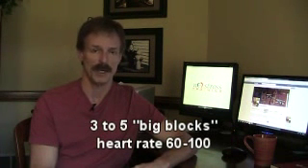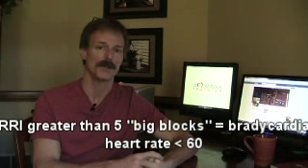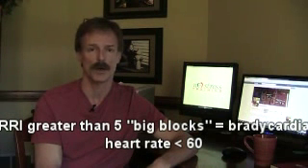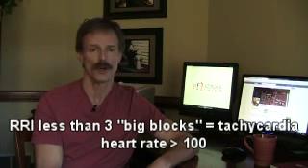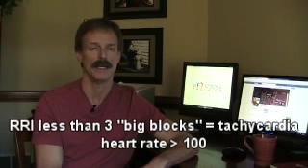This is a very useful way to identify a patient's heart rate because if you train your eye to recognize a normal R to R interval, which is between 3 and 5 big blocks, then you'll notice abnormalities in the R to R from across the room. You're walking through a room and you glance at the patient's cardiac monitor and you see abnormally wide R to Rs on the monitor, then you know your patient's become bradycardic and you can go over and investigate further. Same thing happens if you walk by and you see very, very short R to R intervals. You'll notice that your patient's become tachycardic and you can go over and investigate that EKG.